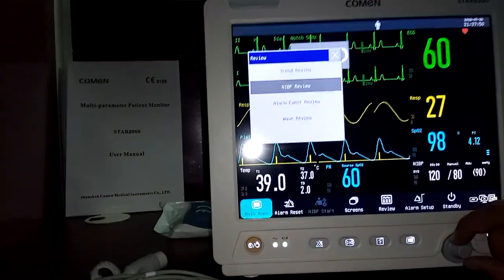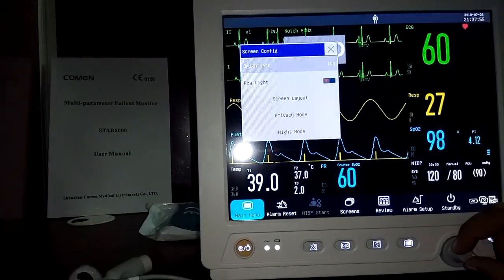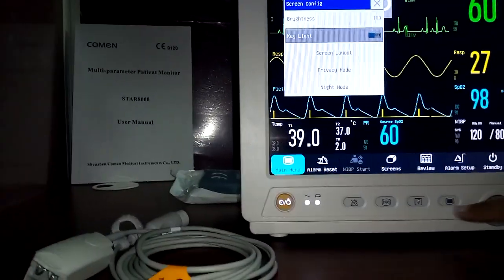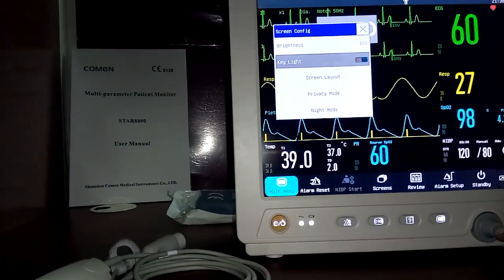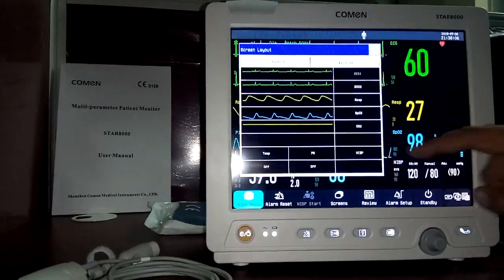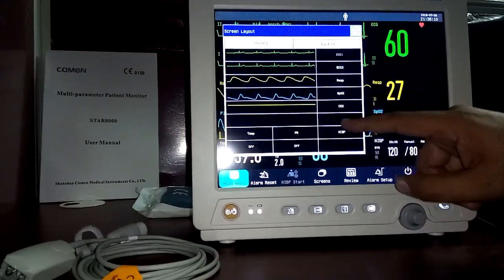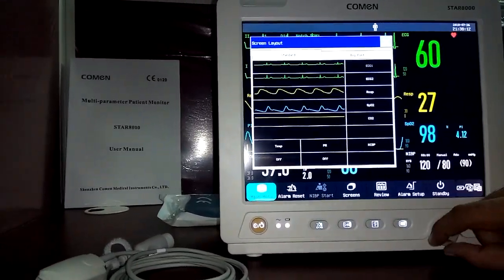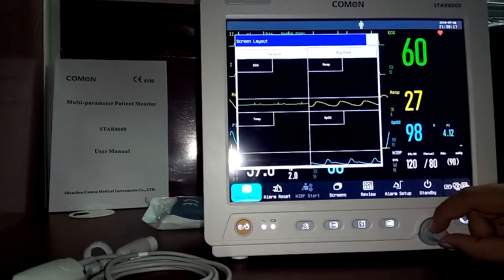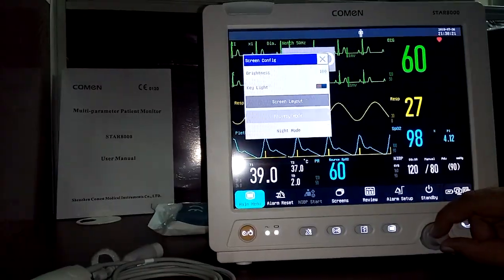In screen configuration, you can adjust monitor brightness and toggle the key backlight on or off. Under screen layouts, you can set how many waveforms to display and where, choose big font or standard screen, and configure which parameters are shown and where.